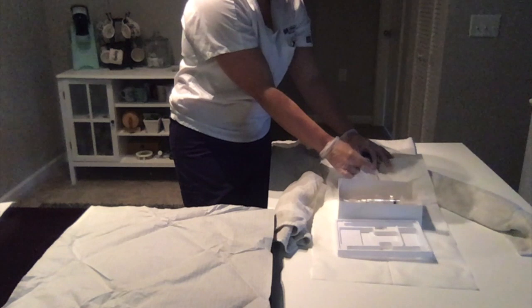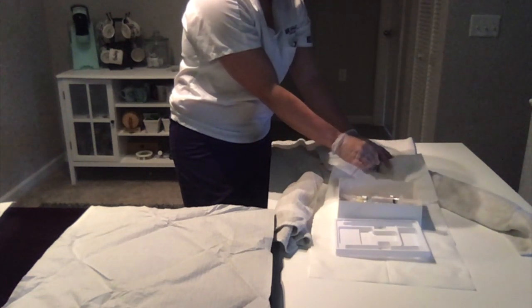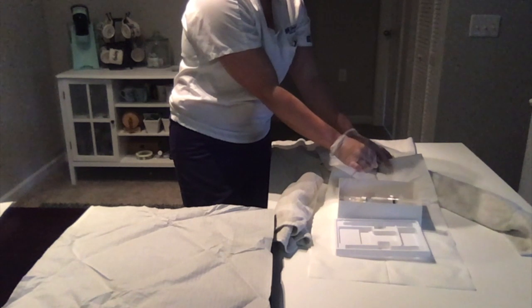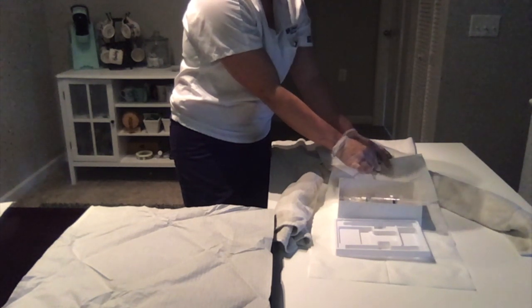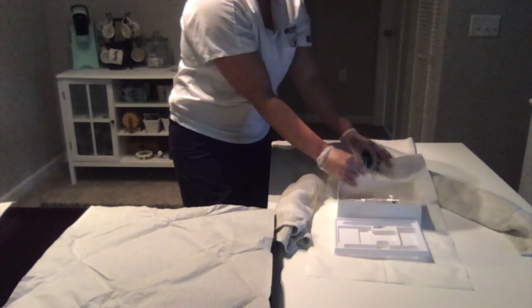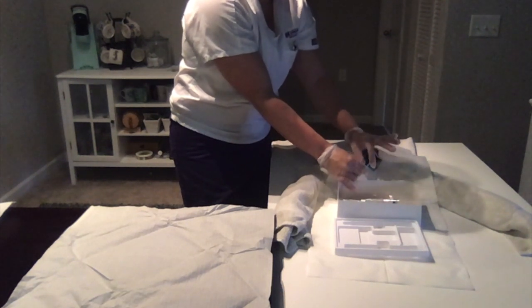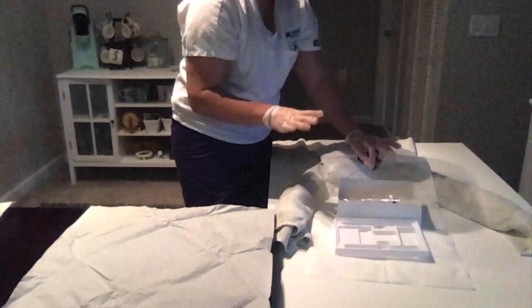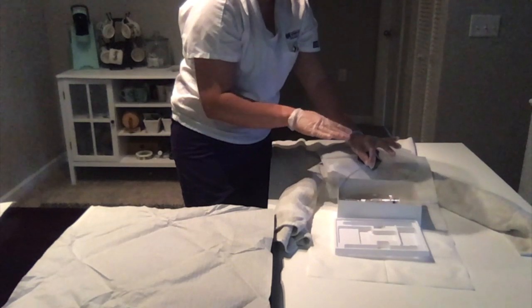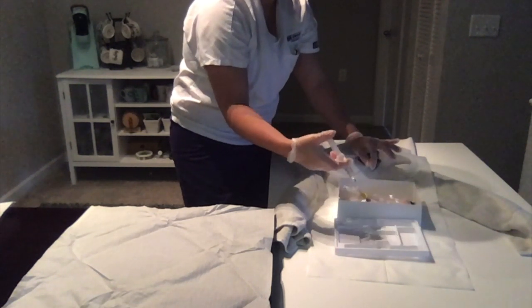And I'm going to advance it with this hand. And then I can see urine. And once I see urine for a female, I'm going to insert it 1 to 3 inches more. So once I insert it, I'm going to take this hand, and because I'm not inserting, I'm grabbing the tube and I'm going to hold it because we don't want to insert anymore. So we can see urine, and we went 1 to 3 inches.